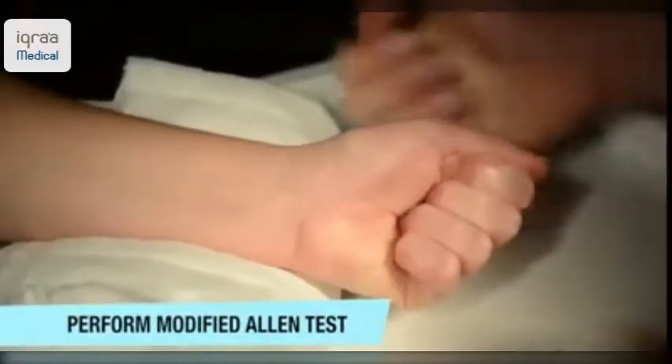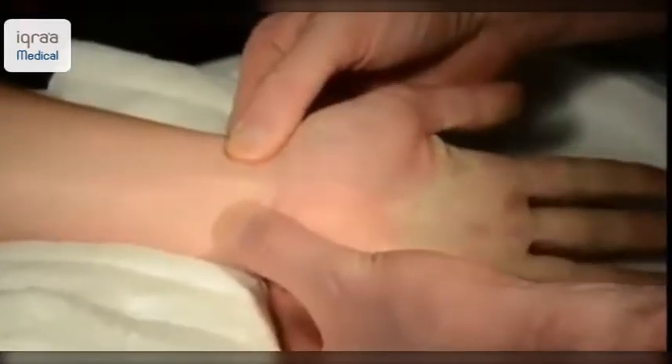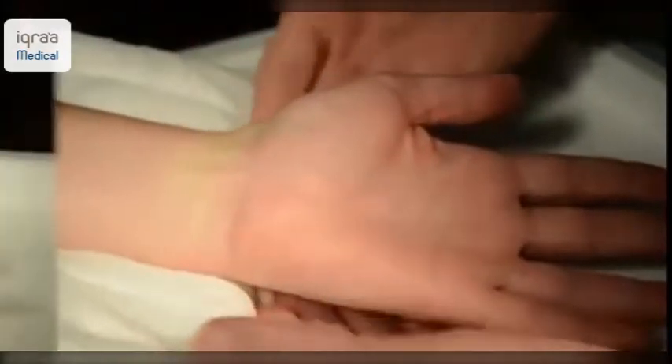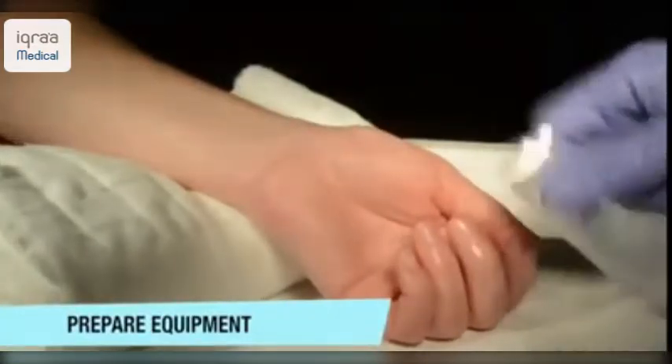Then ensure the patient has adequate ulnar collateral supply by performing the modified Allen's test. Have the patient clench the fist and then release the ulnar artery. A positive test is when the blood returns to the hand as shown.